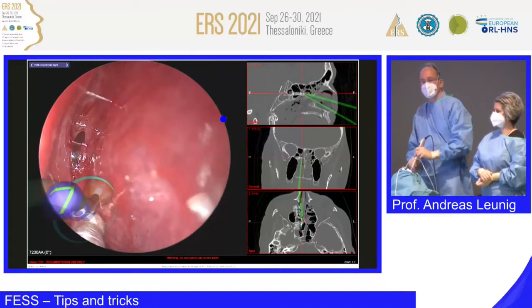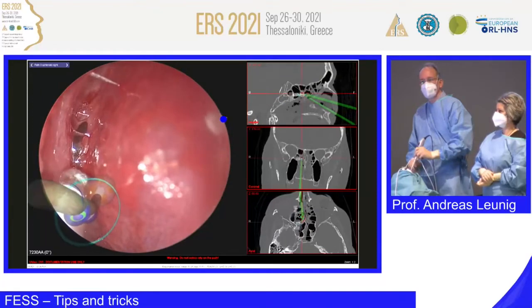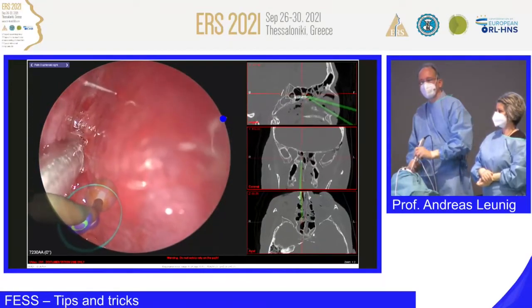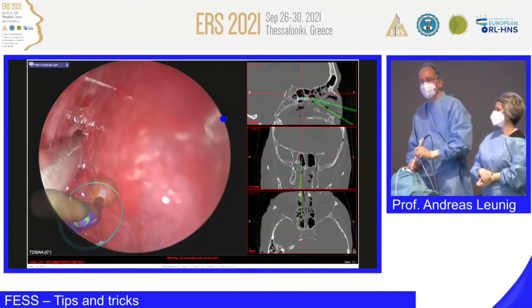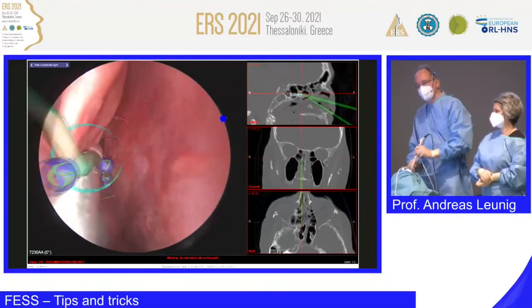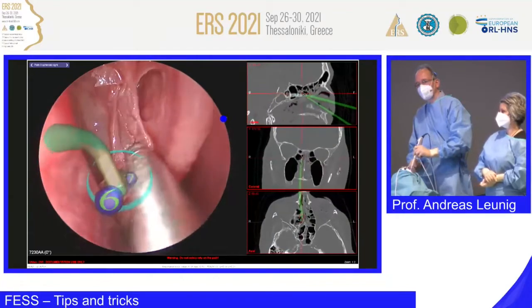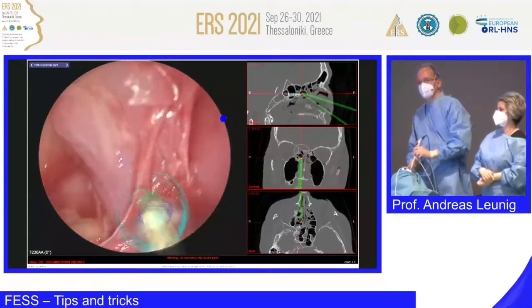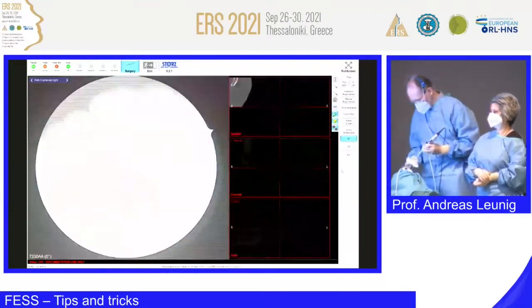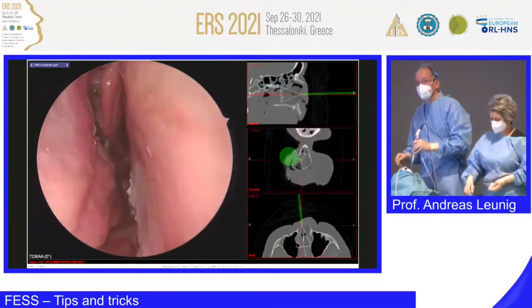Can you see it? And I made the pathway, so hopefully, I mean, I'm in. Maybe it's not exactly the ostium. I go in now, and you see I'm in the sphenoid sinus here. But now we want to do a transethmoidal approach. We're coming back. We try not, you know, breaking the ground lamella or even resecting the ground lamella.